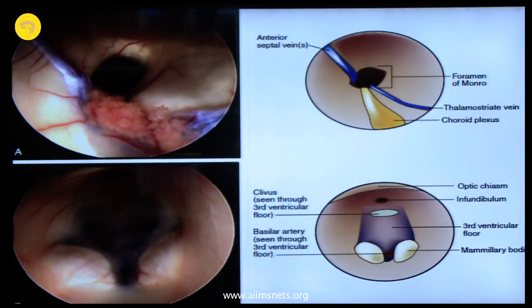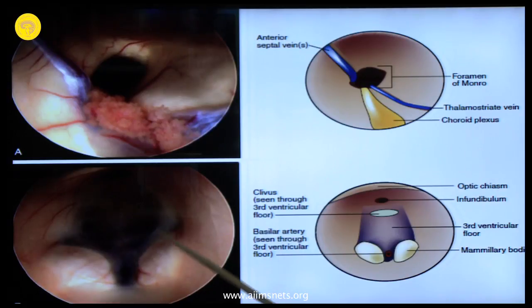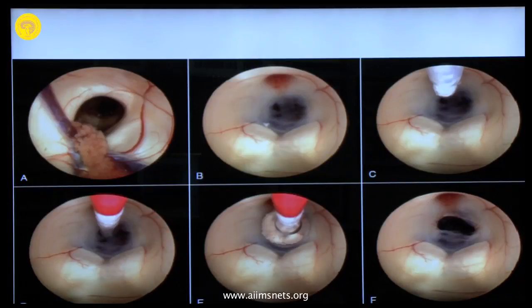I will just show you the endoscopic anatomy — this is how it looks, all of you have seen this. This is a diagrammatic representation of what it looks like: mammillary bodies, infundibular recess, the floor of the third ventricle. Same views showing the point for ETV — a nicely done ETV.